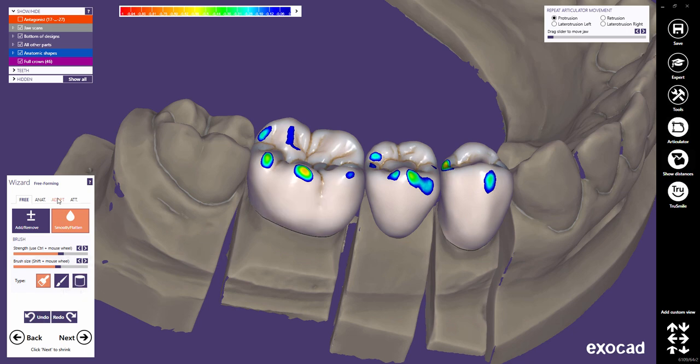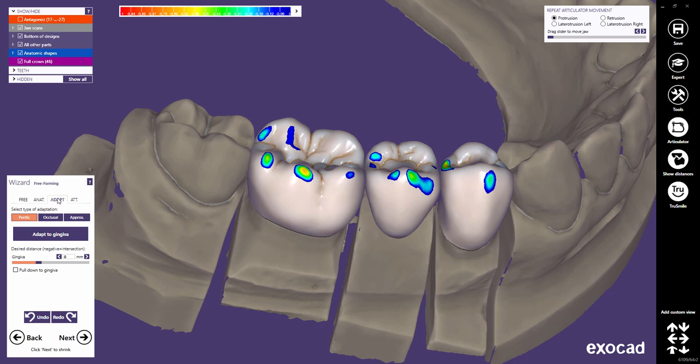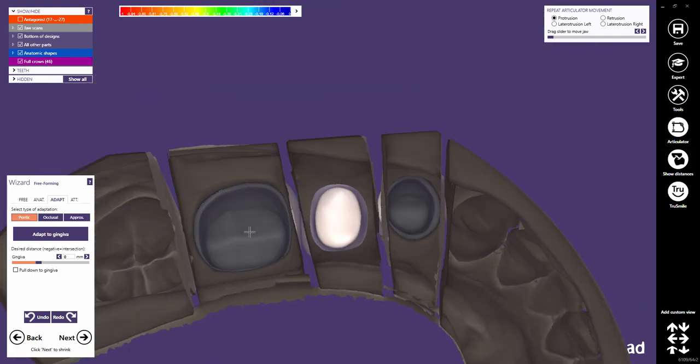Let us now switch to the Adapt tab — another very important tab in the free-forming dialog. Here, you can adapt the pontic to the gingiva, the occlusion, and the approximate contact points. Note that if you proceed to the next step in the wizard without having performed the adaptation, a hint will remind you to perform this step. By default, the adapt step starts with the adaptation of the pontics to the gingiva. In all adaptations, you can define a desired distance by using the slider or by typing in a value. Zero means full contact; a negative value allows intersections, and a positive value creates a gap. You can check Pull Down to Gingiva if the pontic is not in contact with the gingiva. In our case, we don't need that option. Click Adapt to Gingiva to perform the adaptation.